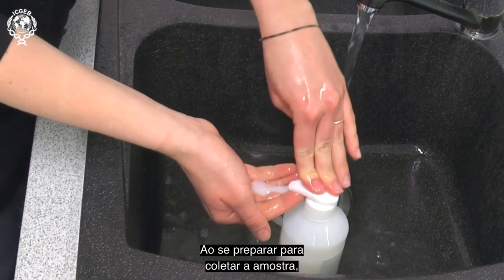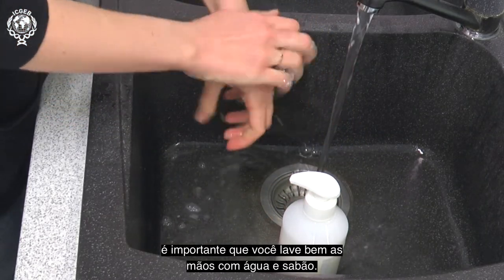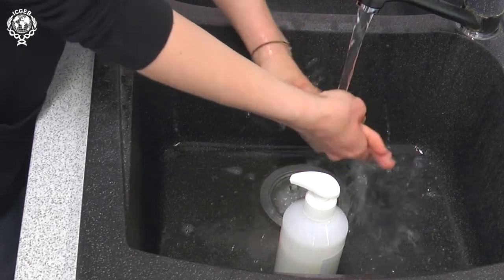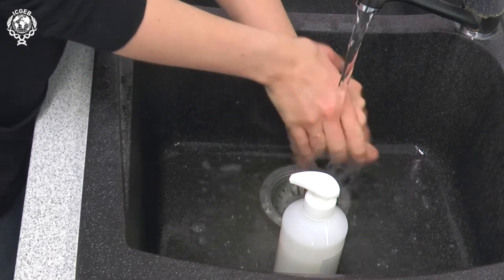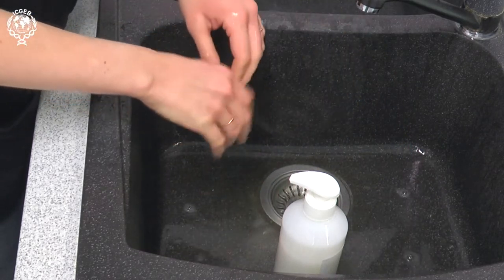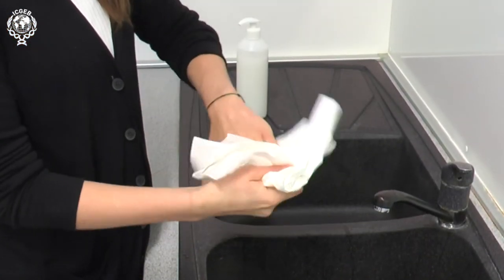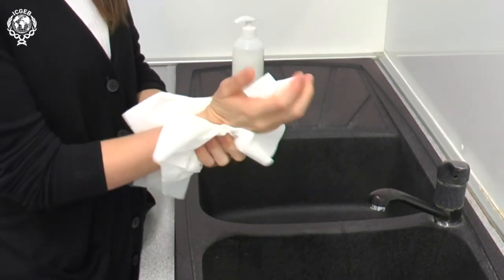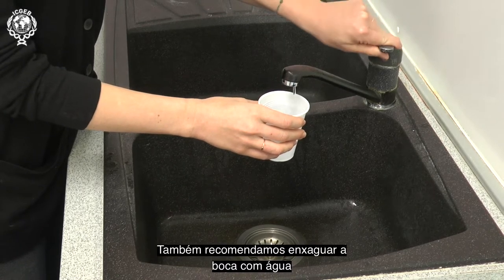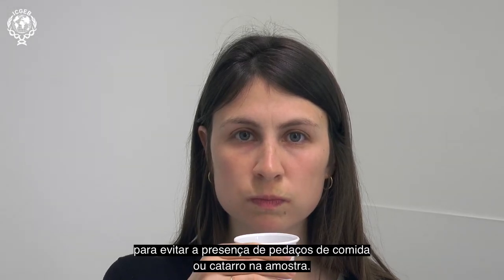In getting ready to collect the sample, it is important that you thoroughly wash your hands with soap and water. We also recommend rinsing your mouth with water, in order to avoid any pieces of food or phlegm being present in the sample.